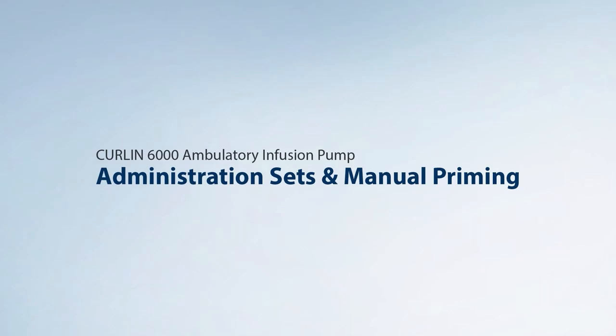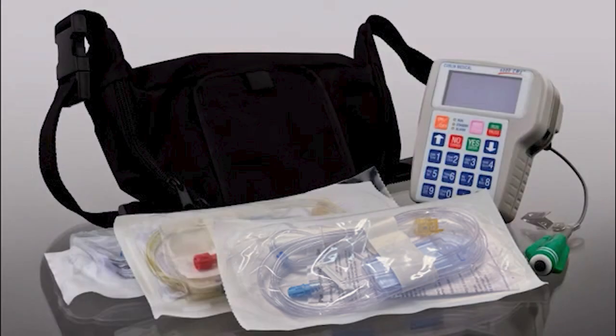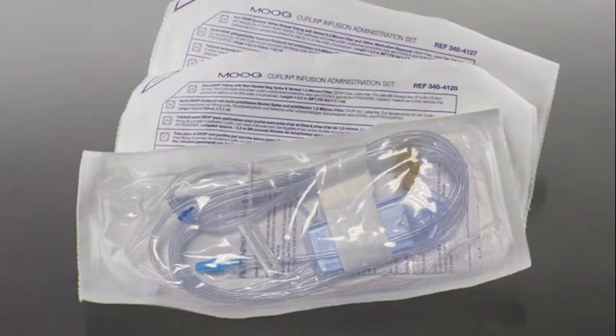Administration sets and manual priming. Moog has a variety of administration sets available. Only Moog's Curlin administration sets can be used with Moog's Curlin infusion pumps. The sets can accommodate IV bags, syringes, or a medication reservoir. Any size IV bag can be used with the administration set.